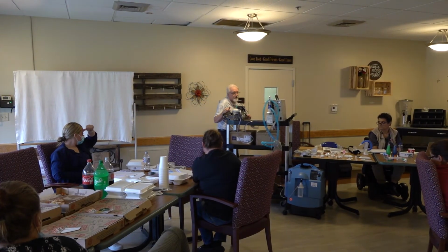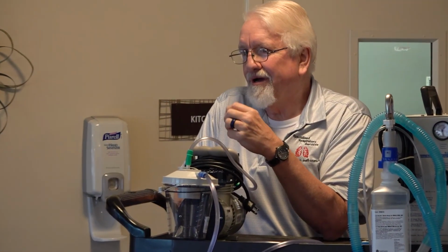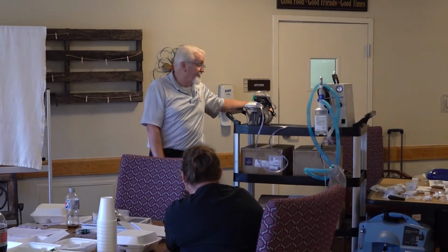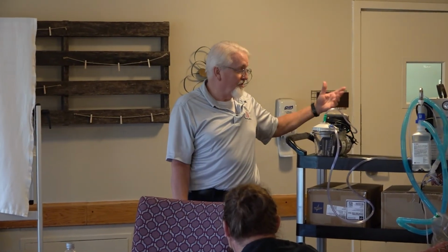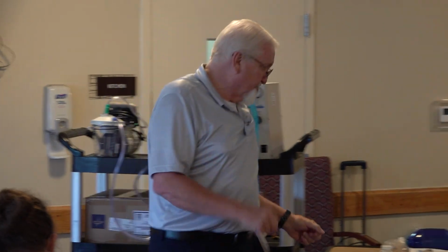I have a question. I have not used these machines before. Are they just like one setting? No, actually, that's a good question. It doesn't really do a very adequate job, but it does. You should set it between 15 and 20. Sometimes, and you didn't hear this from me, you may have to turn it up just a little bit. But 15 or 20 is usually the max on these units, and usually they're already going to be preset to that.